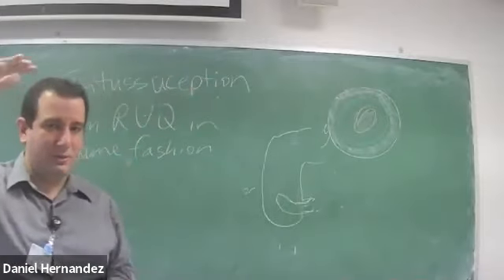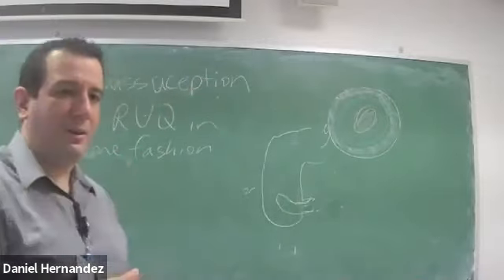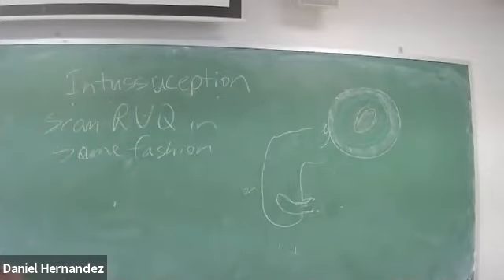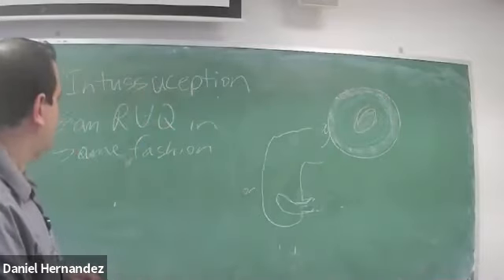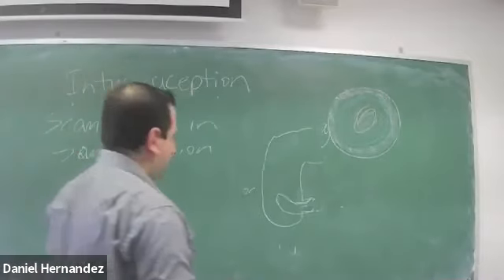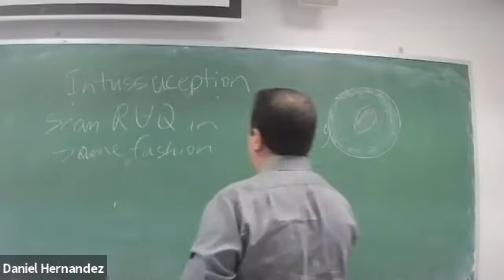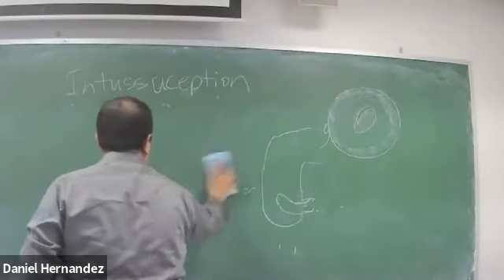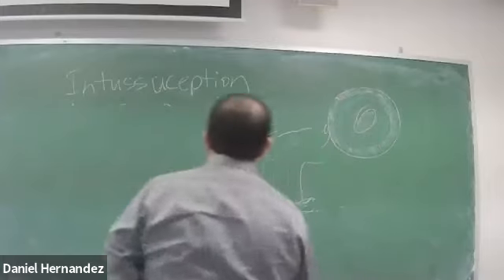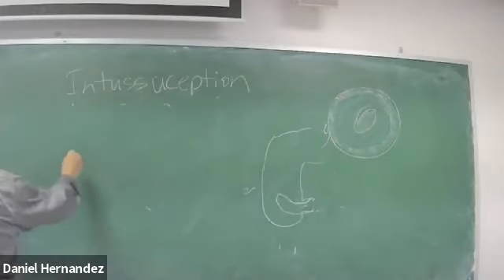Start in transverse, start superior to inferior, just work your way down. And scan lateral to medial. And then we'll just continue working our way across that child's abdomen.